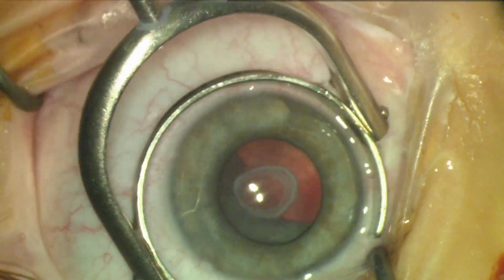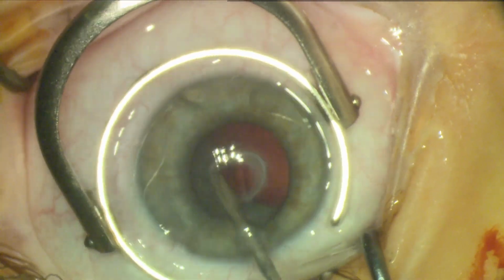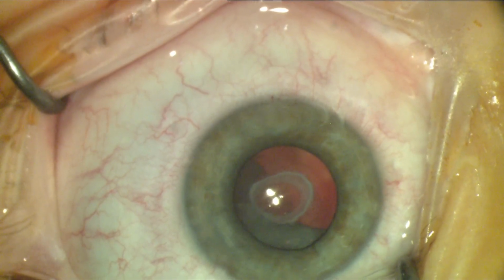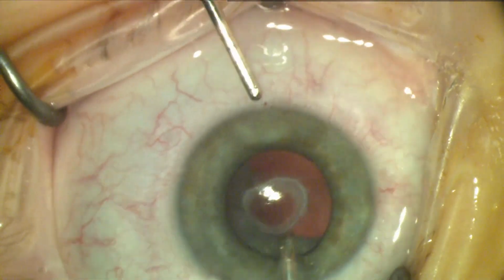I use a 20 or 23 gauge MVR blade depending on how large the eye is. When making cuts, I am very careful not to hit the posterior capsule and I stay fairly close to the center of the capsule and do not extend to the periphery to avoid damaging any zonules.